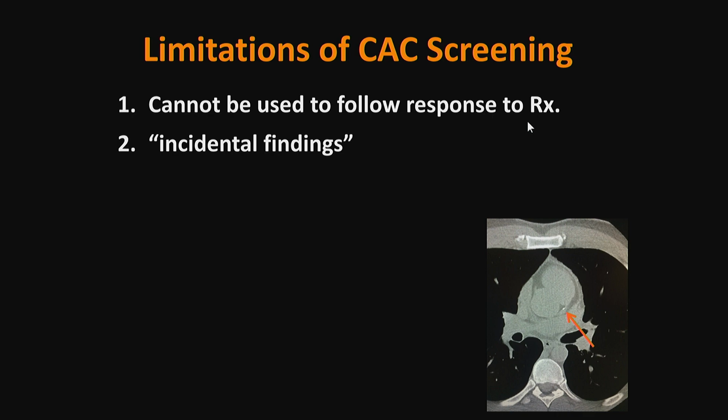When we perform CT scans, such as when we do calcium screening, there is a small rate of finding incidental findings. This generally occurs 5 to 10% of the time. And at times these may be important findings, but at times they can be trivial pulmonary nodules, and the detection of such findings may create unnecessary anxiety for patients. Certainly there's been a change in the criteria regarding nodules that require follow-up, and it's important to know that many small nodules are completely benign.